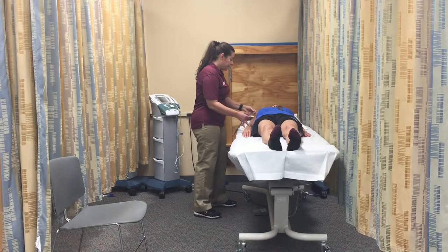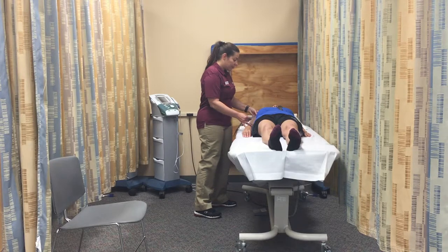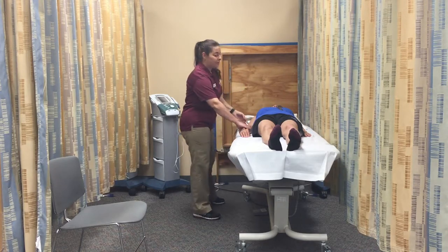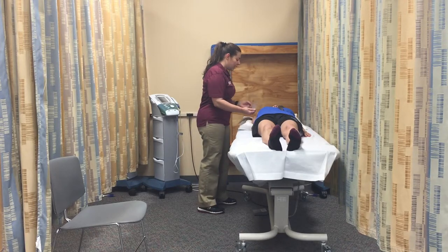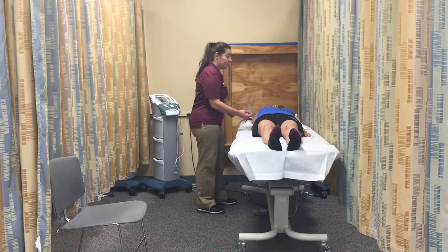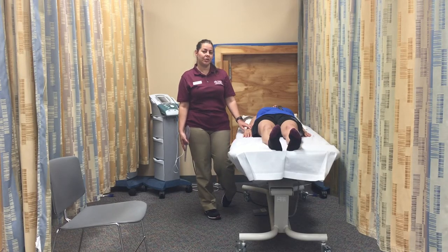I'm going to be using the medial epicondyle of the humerus as the point of reference. I'm going to align the goniometer with my anatomical landmark. We are recording the range of motion of the starting position, which is zero. I'm going to remove the goniometer, perform a passive range of motion, replace the goniometer, and align with the anatomical landmark. I'm going to measure and record the range of motion of the ending position, which is 180 degrees. And this is how you measure the range of motion of the abduction of the shoulder. Thank you.